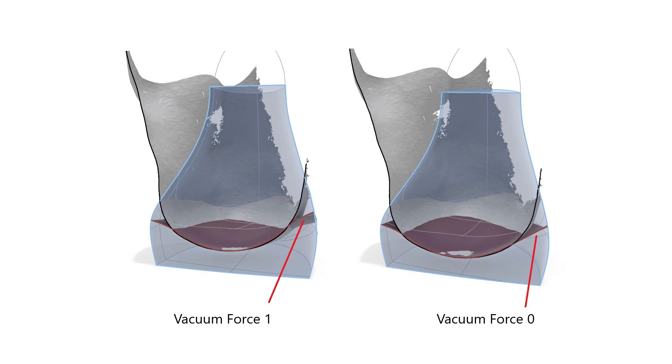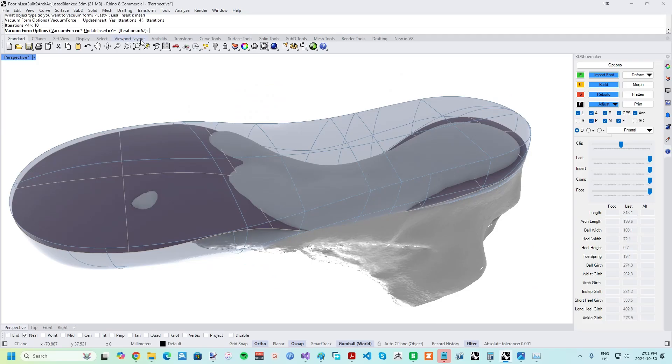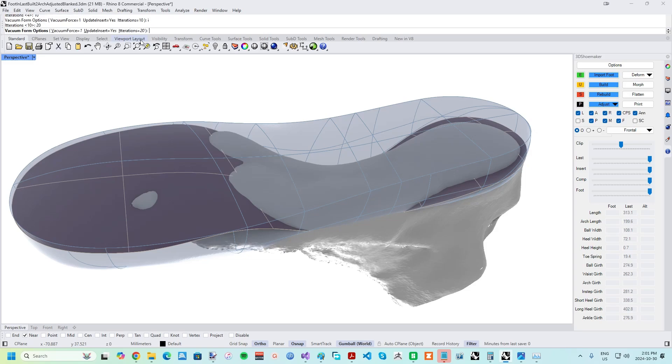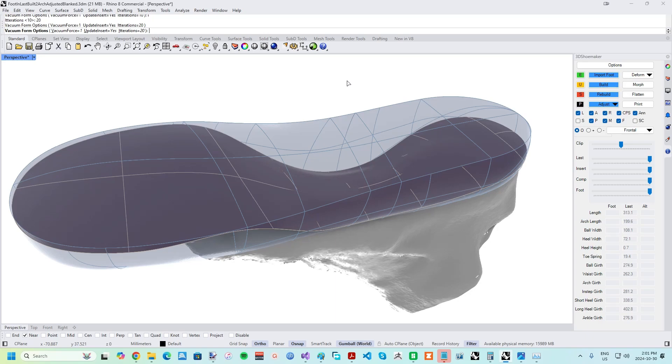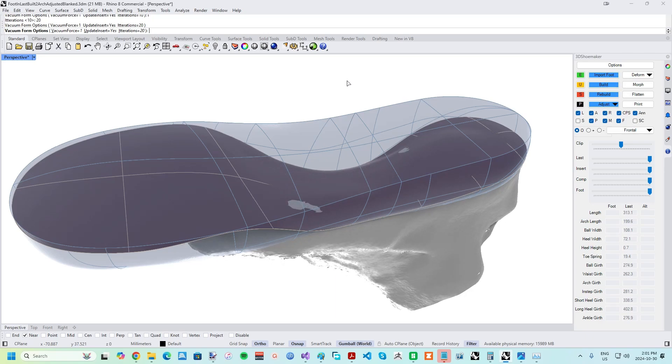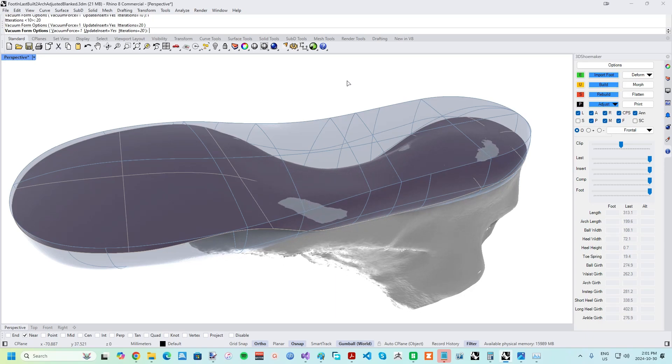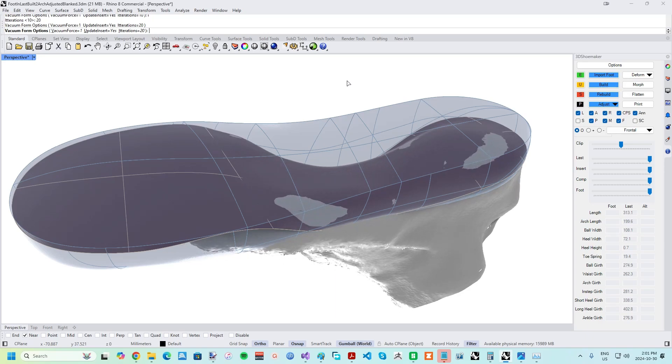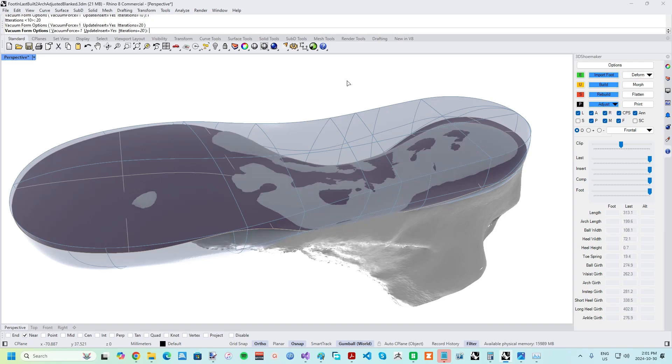A mid-range Vacuum Form is perhaps most ideal for comfort for the final orthotic. Also in the command prompt is the setting to toggle whether the Insert boundary is updated, which in most cases makes sense. And there is also the Iterations settings, with a higher number taking more time but resulting in a closer match between the orthotic and foot surfaces. Once satisfied with the settings, press the Enter and the Vacuum Forming is carried out.